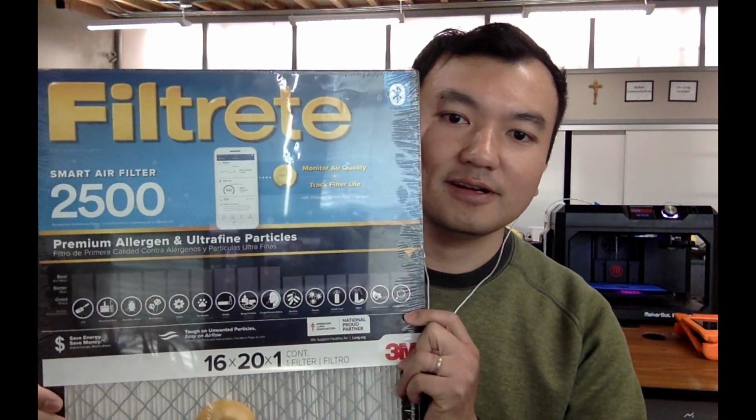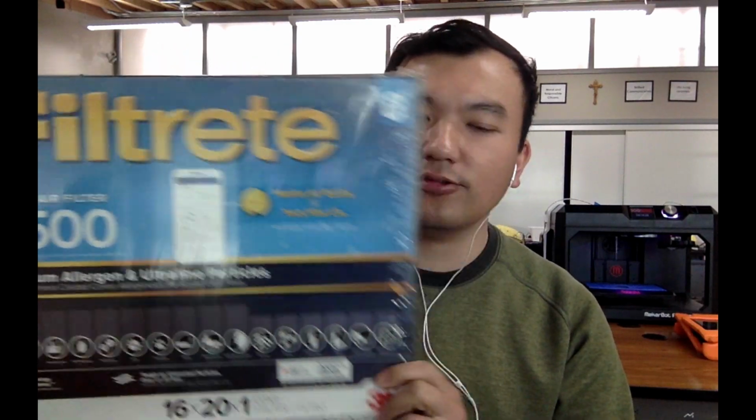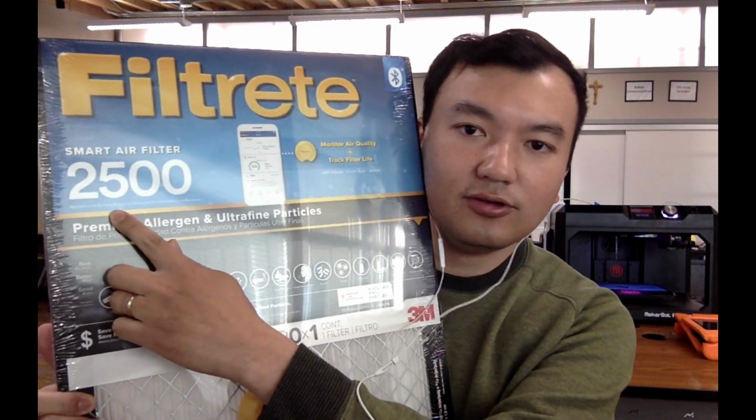Okay, it's time for us to install the filter. Here's my big pack of filter. You can get this at the hardware store. It's basically AC or furnace filter. And notice this is the model number that I chose to go with.